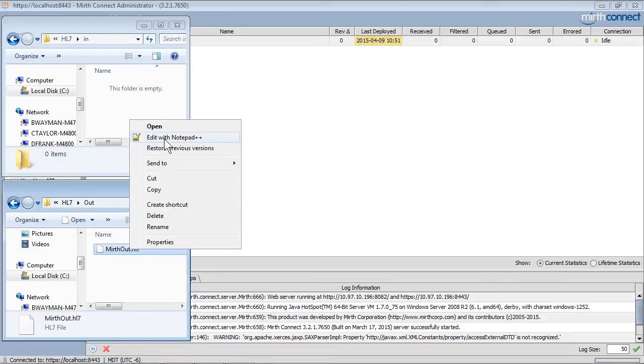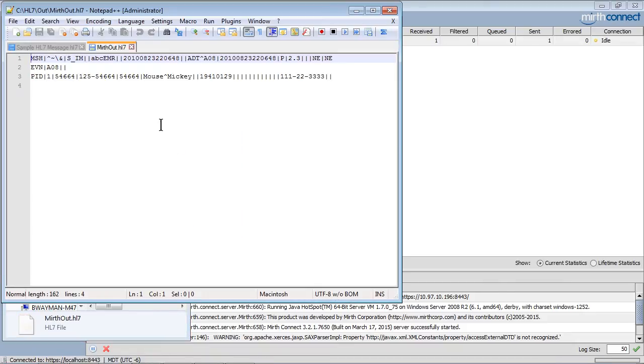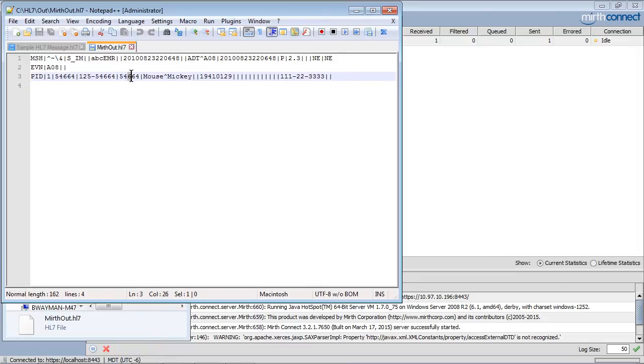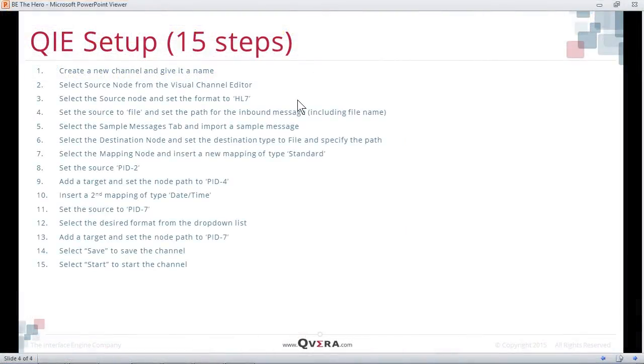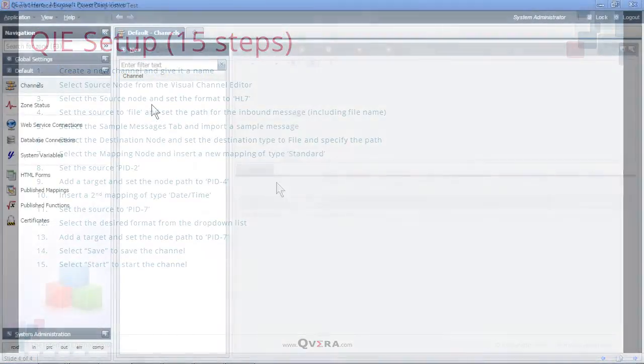We can now open it up in a text editor and verify our changes. In this particular case, we took the patient's ID from PID2 and put it into PID4, and we reformatted the patient's date and time of birth. We will now demonstrate these changes in QIE.